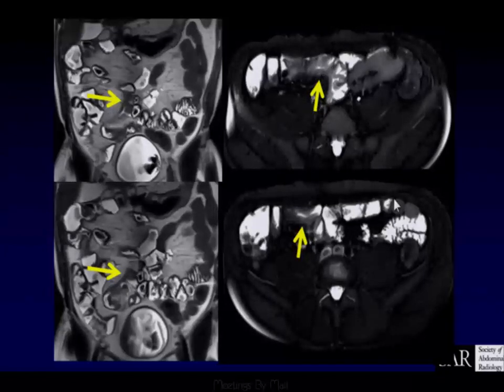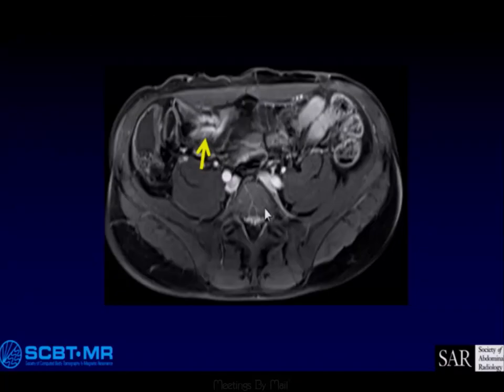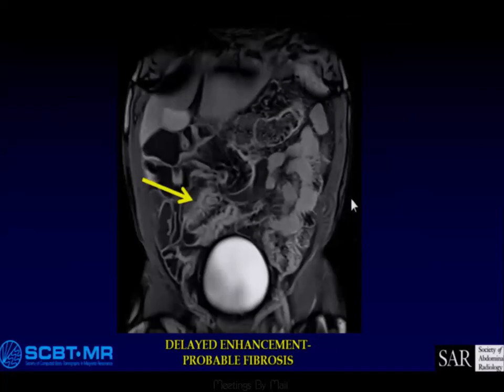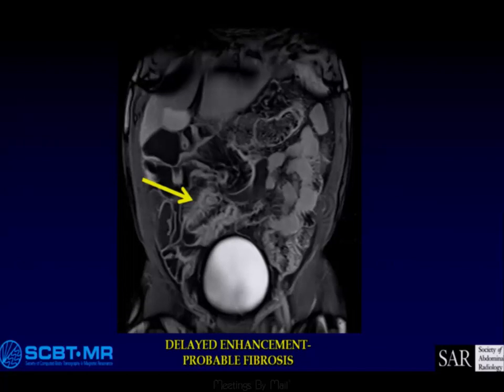Here we are on the fat-saturated images where we have T2 bright, the hyperenhancement, the ADC map, and restricted diffusion. There's more and more evidence that if we do delayed post-contrast imaging, post-contrast enhancement on delayed imaging is very indicative of fibrosis. So we're getting better and better at being able to quantify whether fibrosis is there and how much.